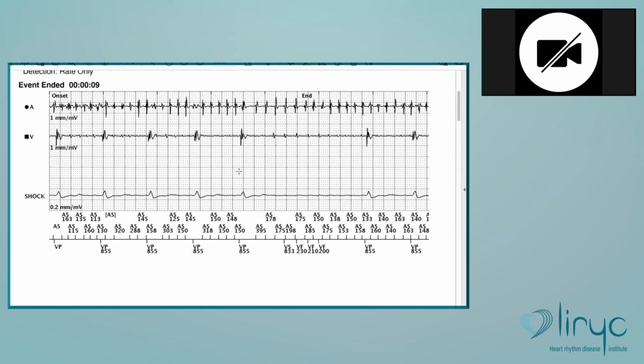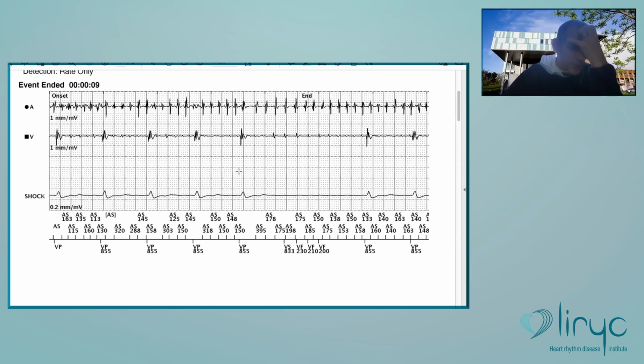It's because of different parameters, and we will not discuss it too much, but it's the automatic gain control in Boston, and it's considered to be much more sensitive after pacing than after sensing. Therefore, after pacing you increase the risk of oversensing very small signals.